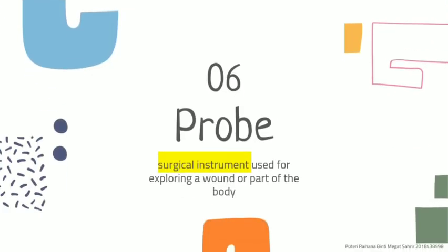My name is Puteri Rahana, and today I will talk about probe, a surgical instrument used for exploring a wound or part of the body.